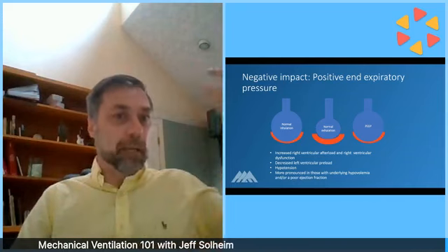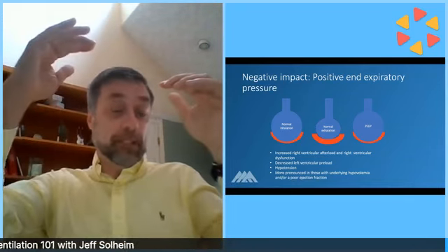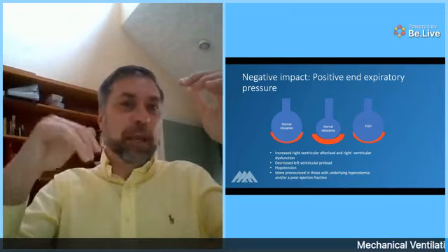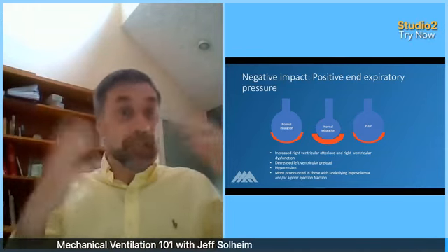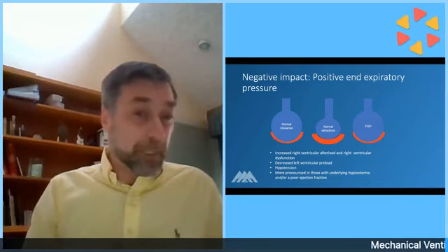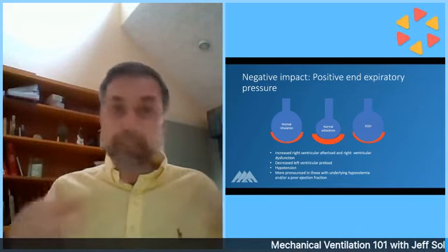So I'll increase that PEEP maybe from 5 to 10 and decrease the FiO2 from, let's say, 100 down to 70. Okay. You're playing some guessing games here, but I'll decrease the FiO2 from 100 down to 70. I'll increase the PEEP from 5 to 10 if the pressure is stable, and then I'll sit on it for a while. I'll watch the patient. Does their pressure tolerate that elevated PEEP? If it does, great. If not, I might have to give them a little bit more vasopressor.